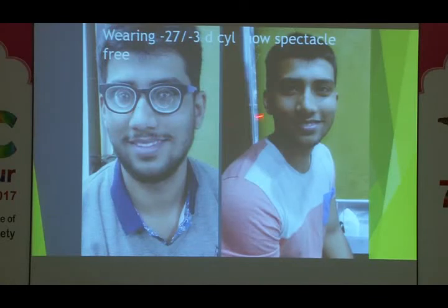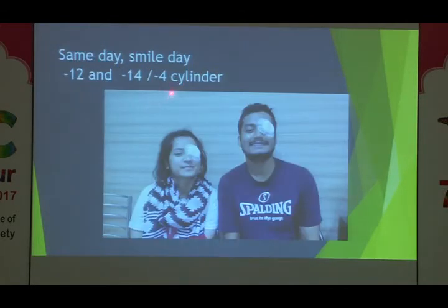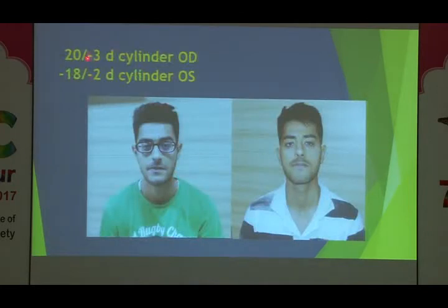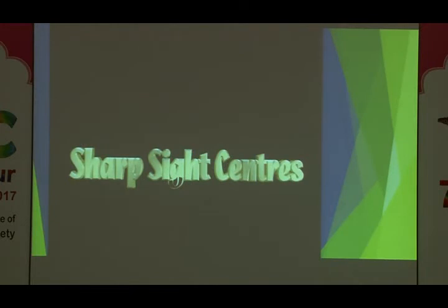Life-transforming surgeries. Look at the patients, happy patients. We could never do anything for such patients, such high myopes. Minus 16, minus 12, minus 20, 18, we do two diopter cylinder. So the phakic lenses, I guess, are here to stay. They will help not only our high refractive error patients, but also patients where we cannot offer LASIK for them.